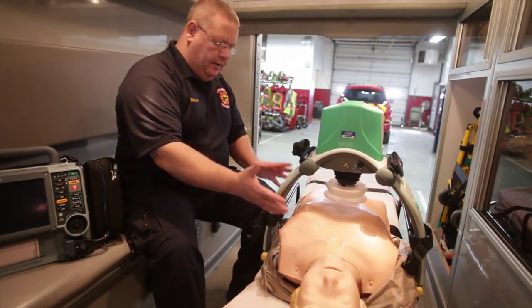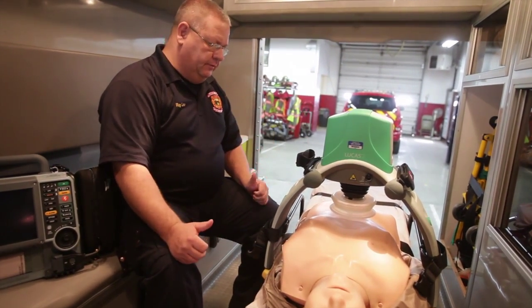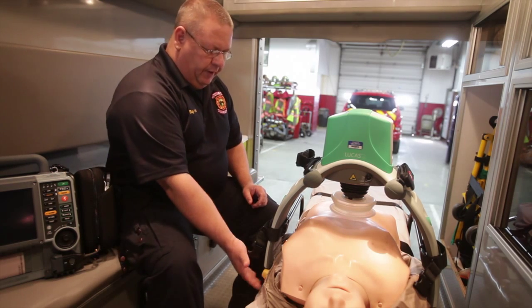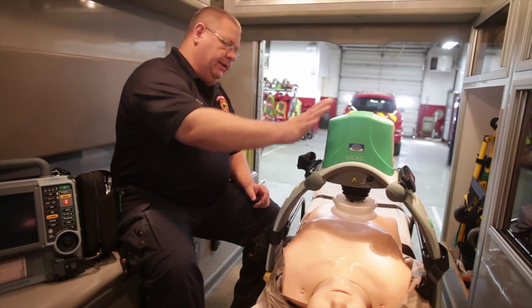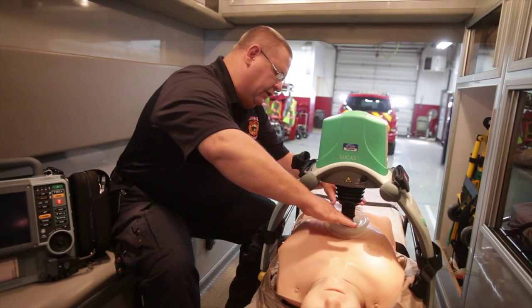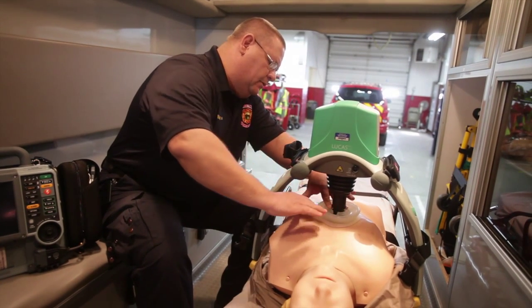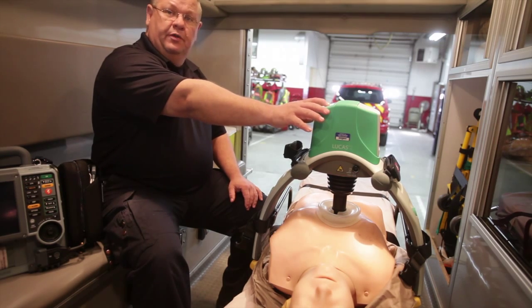What we do is the unit pretty much encapsulates the patient with the plate underneath. It clips onto the plate. Turn it on and go ahead and get it set. The unit itself sits on the center of the breastbone, and then we go ahead and turn it on and it'll do CPR for us.